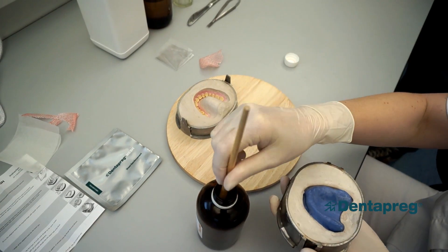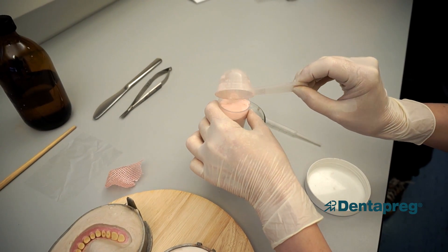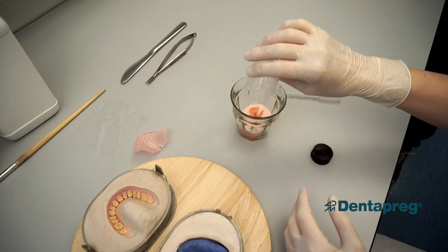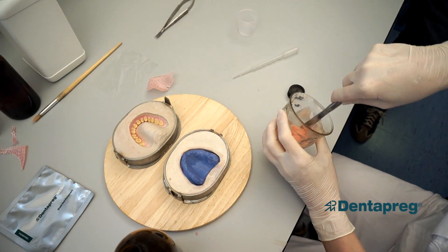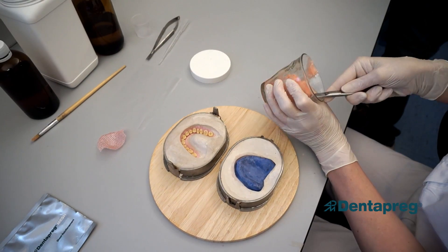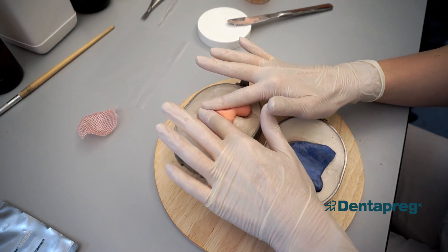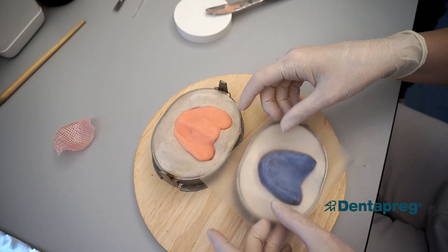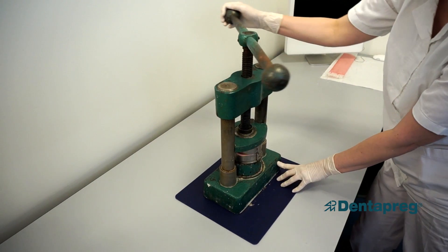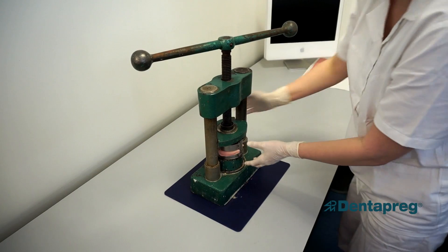Isolate the stone model and prepare the acrylic dough. Apply the first layer of acrylic on the half of the flask with teeth. Now cover it with the provided transparent foil and close the flask. Place the flask under the press — do not press it all the way, just so that the layer of excess acrylic dough coming out is approximately one to two millimeters thick.